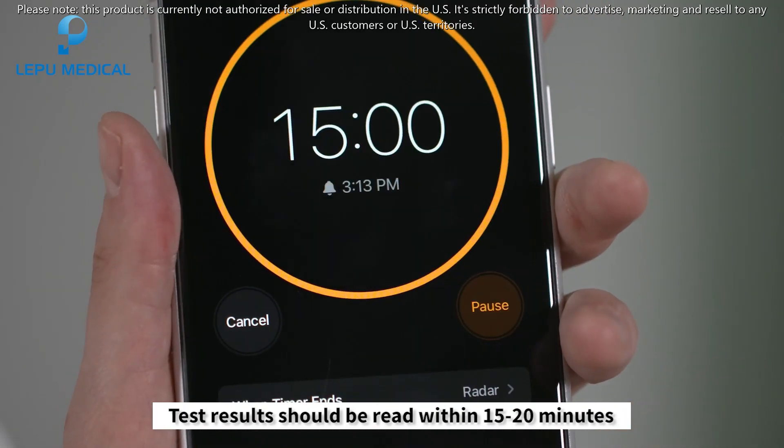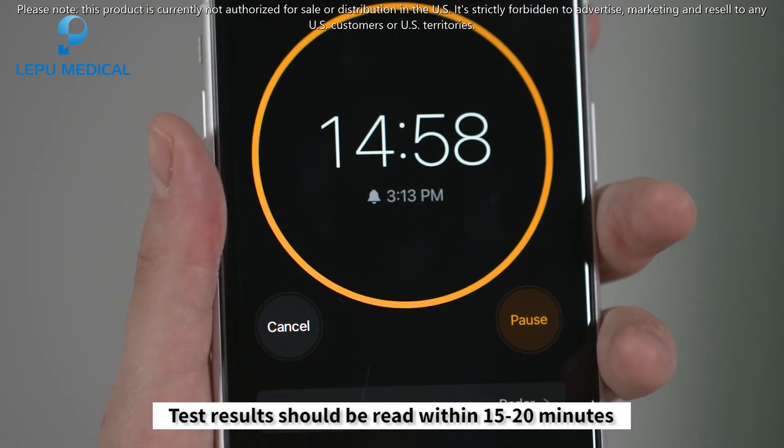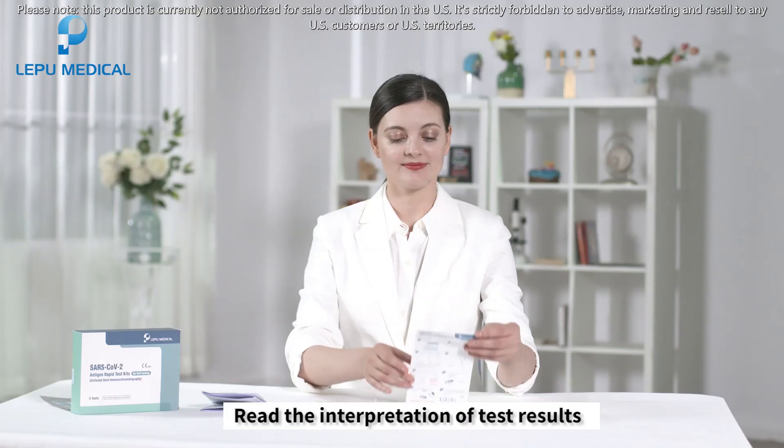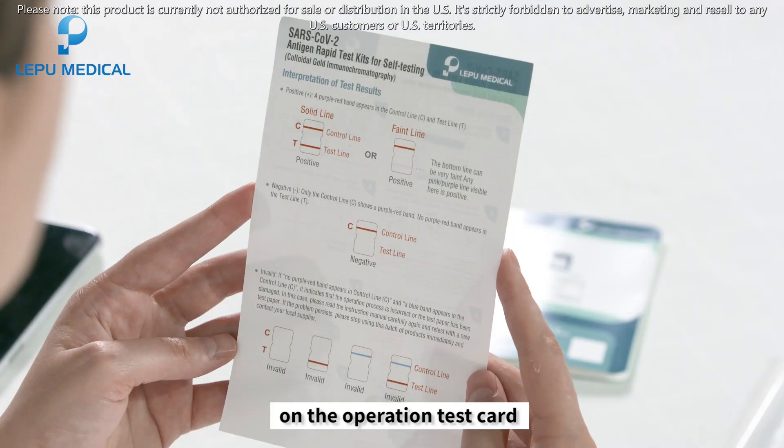Test results should be read within 15 to 20 minutes. Next, check your results by reading the interpretation of the test results on the operation card.